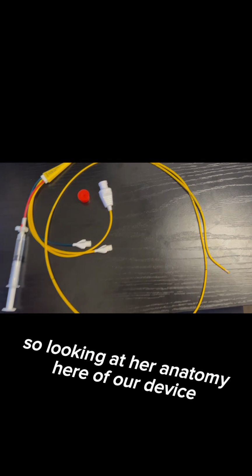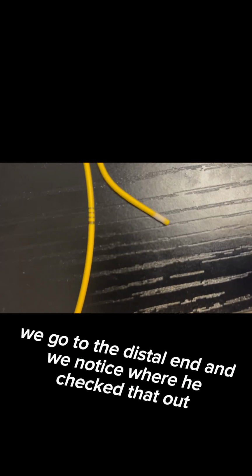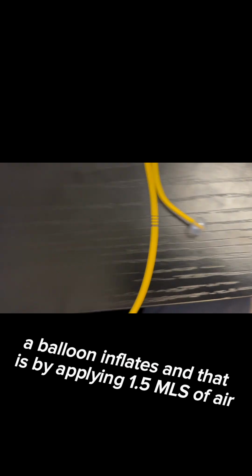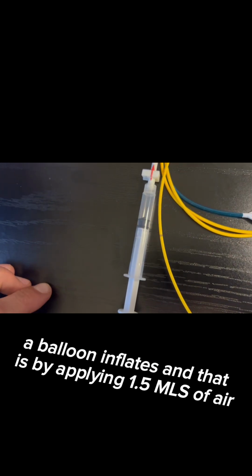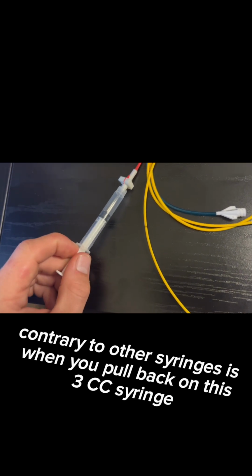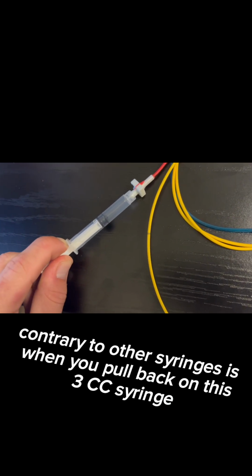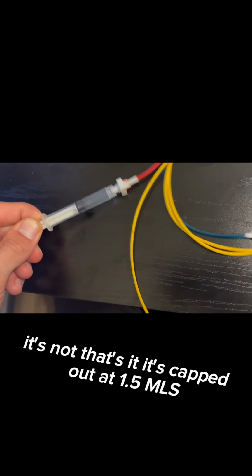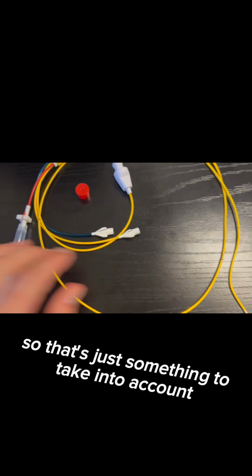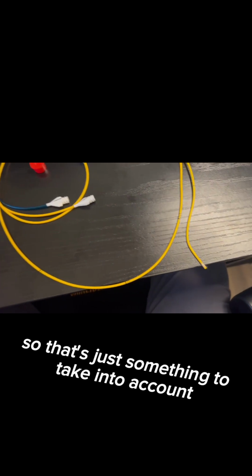So looking at the anatomy of our device, we go to the distal end and we notice, well, hey, check that out, a balloon inflates. And that is by applying 1.5 mLs of air. What's really interesting about the syringe, contrary to other syringes, is when you pull back on this 3 cc syringe, that's it. It's capped out at 1.5 mLs. So that's just something to take into account.